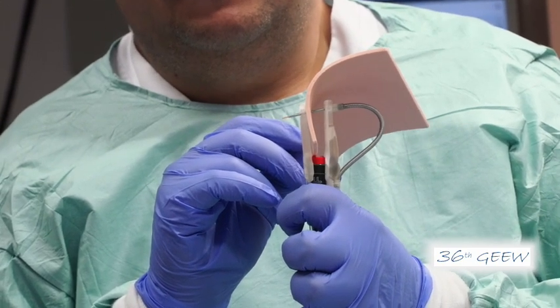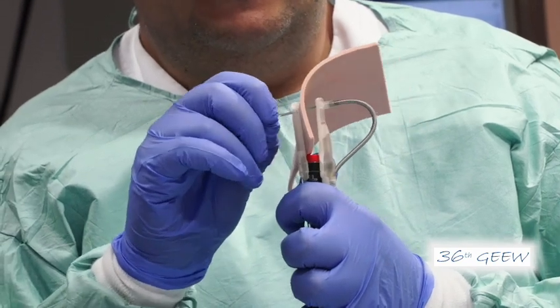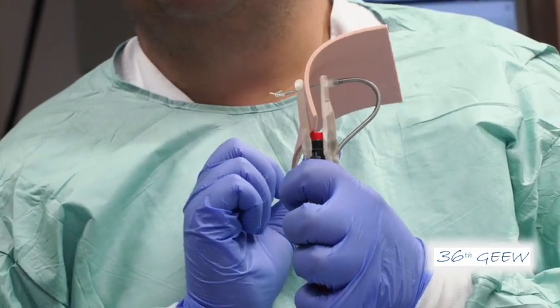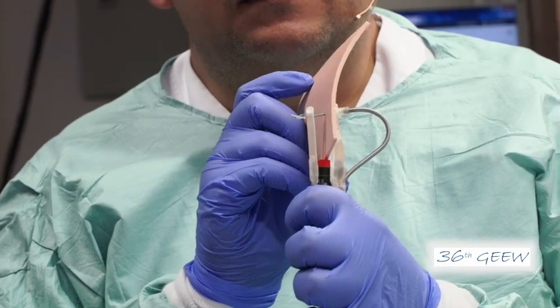I'm trying as much as I can. Because you have been always the doctor, not the nurse. I can help you a little bit. Thank you, sir. I helped Vincent, and then he will pull back — now I'm removing the needle.